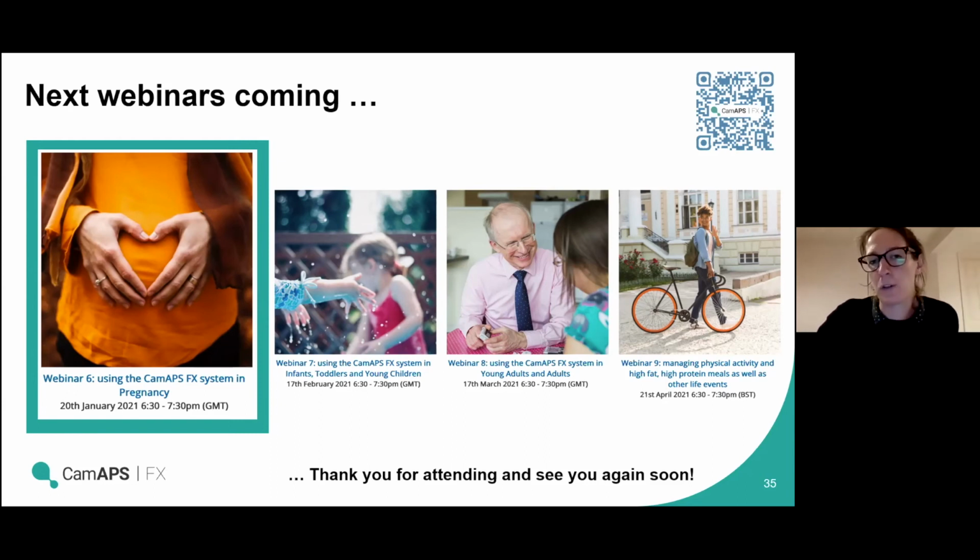The nice thing about Boost over and above what you would most likely liken it to, which would be an increased temporary basal, is that once the glucose reaches the target, it won't continue to give more insulin, whereas a temporary basal would until you turned it off. So you can put Boost on for 4 hours and keep an eye on the glucose, but knowing that after 5.8, it's going to back off, and it will only then aggressively treat excursions above 5.8.